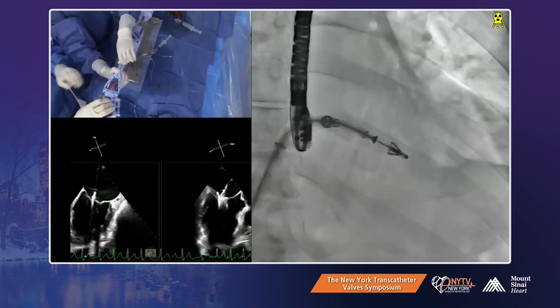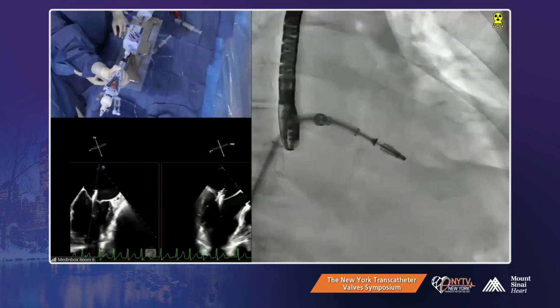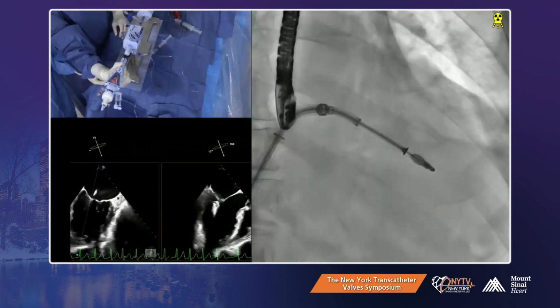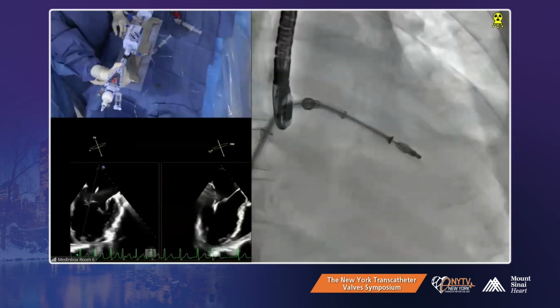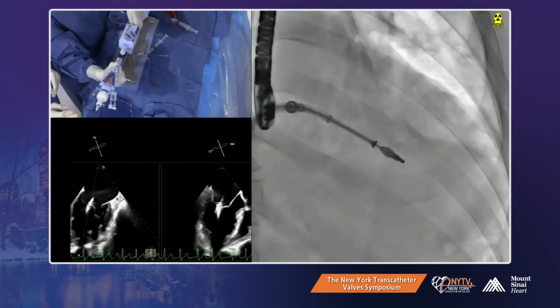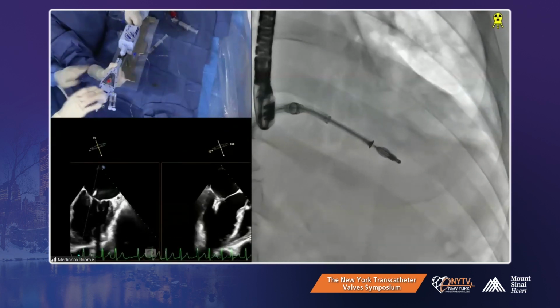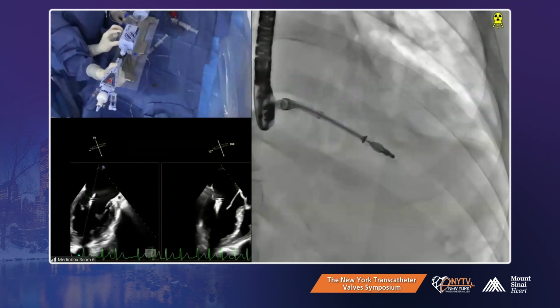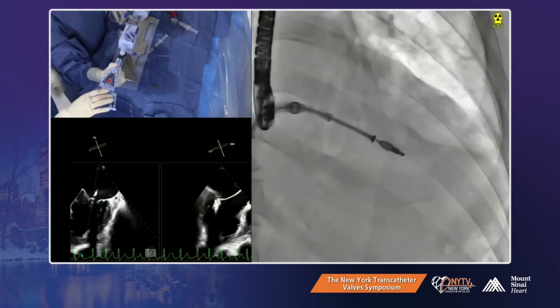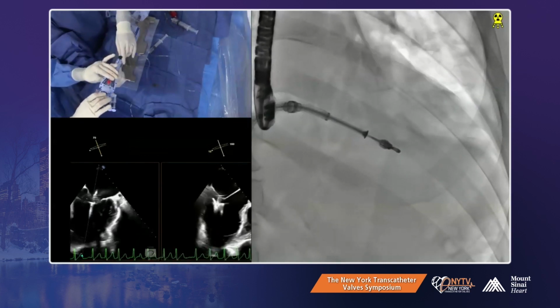All right, we'll close the clip and go in and try again. Yeah, that looks better. But the question is, can you keep it in that orientation? Yeah, we can. Okay, we're already in. Take a little bit of medial. Very little M actually. Our M is 12 o'clock. Yeah, it's all because of the plus. So okay, all right, let's try again.